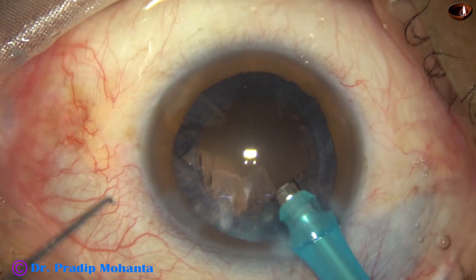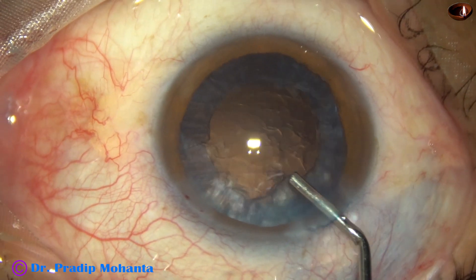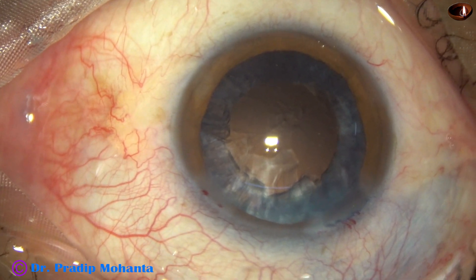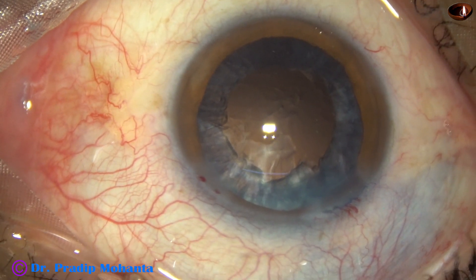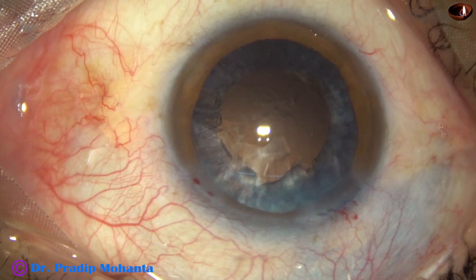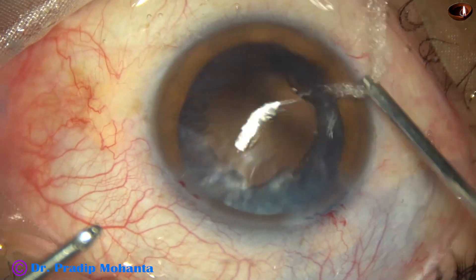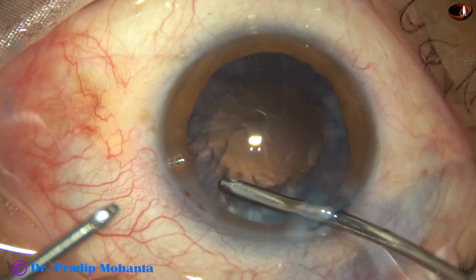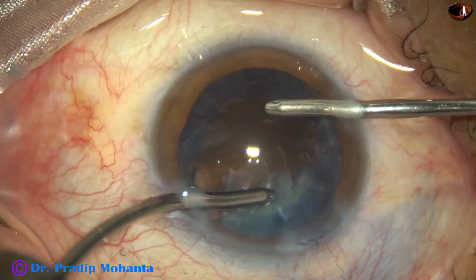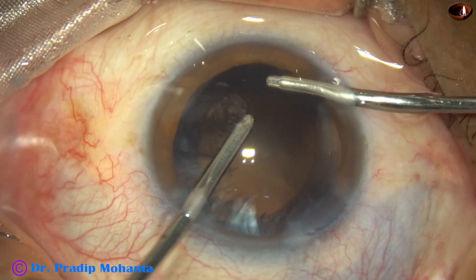And I come out. The anterior chamber is now filled with HPMC. In this case, I am going to use bimanual irrigation-aspiration. With the irrigating cannula, I hydrate the cortex first so that it gets loosened. Then I use irrigation and aspiration together, and see how easily the cortex comes out once it is nicely hydrated.